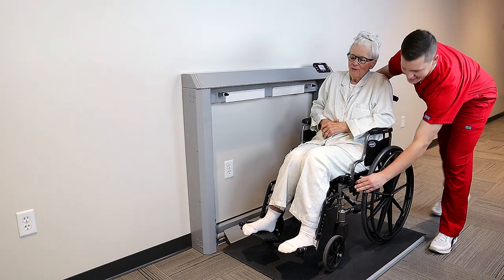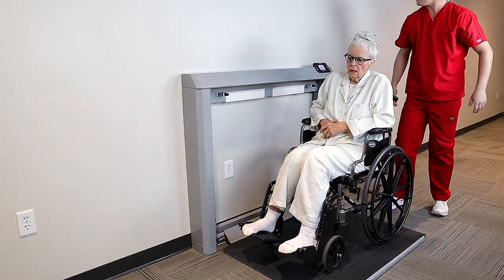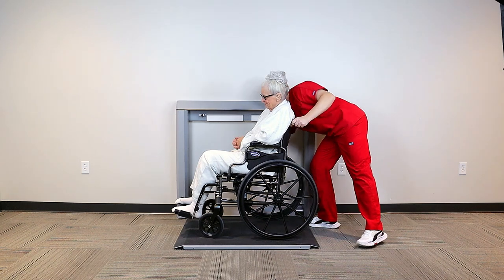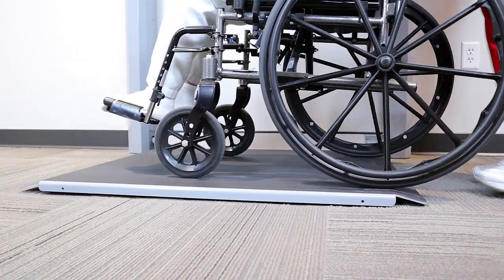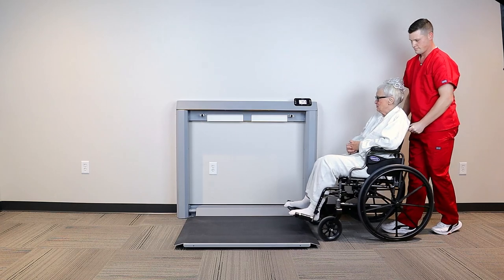The patient is simply rolled backward onto the scale's generously sized platform for weighing. When the patient has been weighed, they may be rolled backward off the scale. The one and a half inch (38 millimeter) high platform is very low to the ground for patient access, making the process easy with minimal effort required to roll the patient on and off the weighing platform.